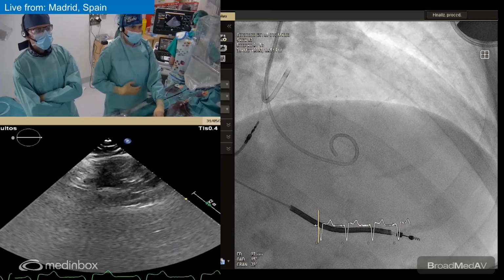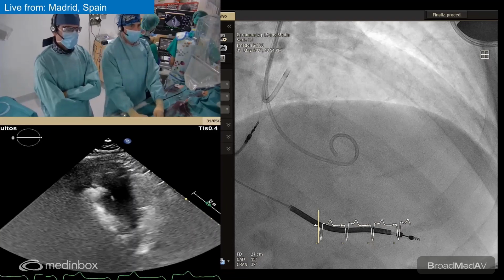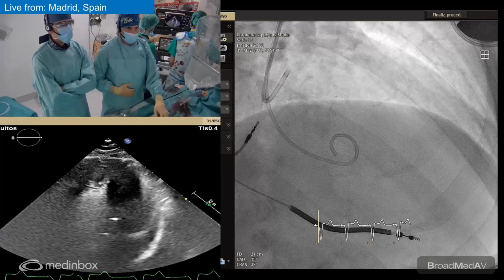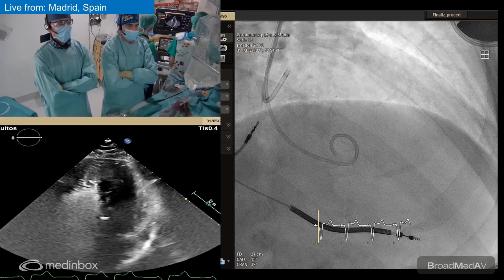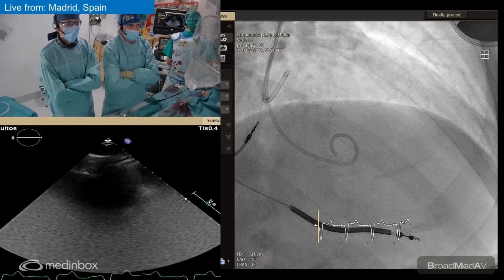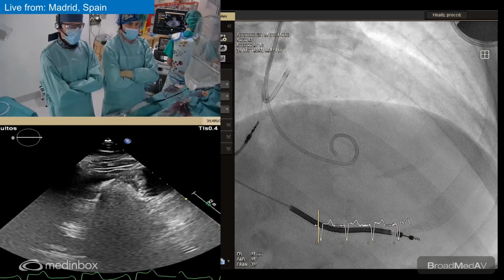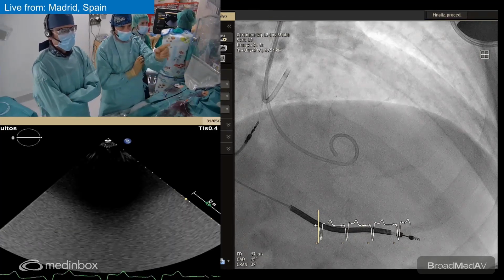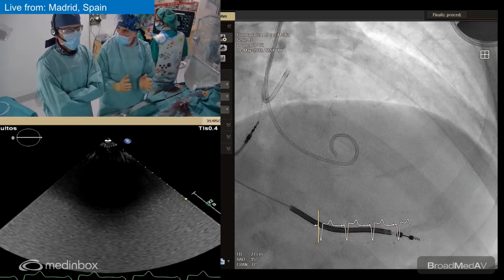Important to repeat the doses of fentanyl or whatever you use to relieve the pain. There is also a less pronounced systolic anterior movement. We're doing something. I don't know if it's only the sum of the whole thing we have done, but for sure the gradient has decreased. Yeah, it's looking good, this last one. It's not 0, but yeah. But the ventricular pressure has also decreased. Maybe some stunning. Stunning, yeah.